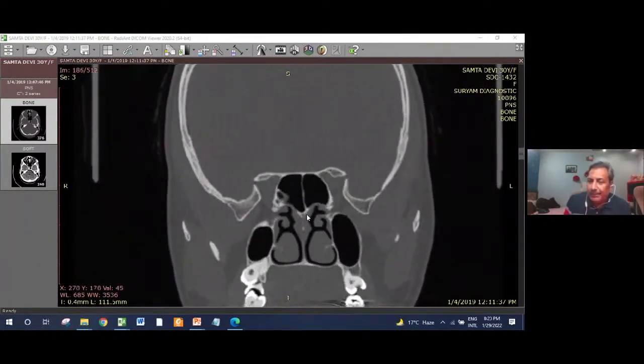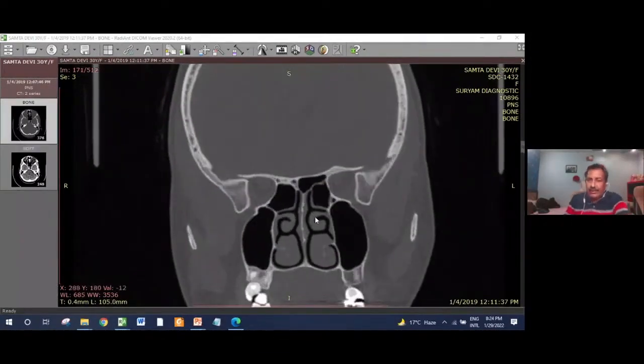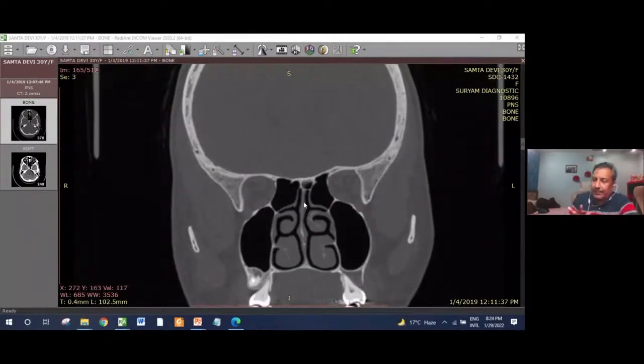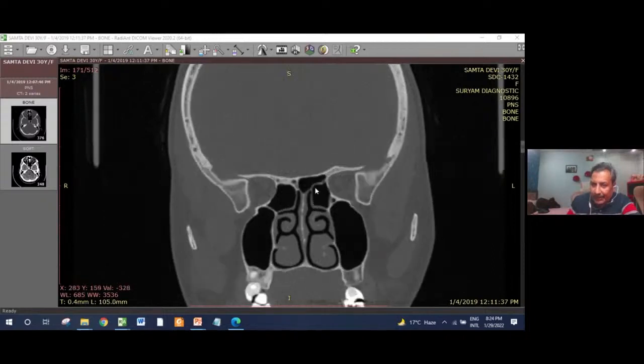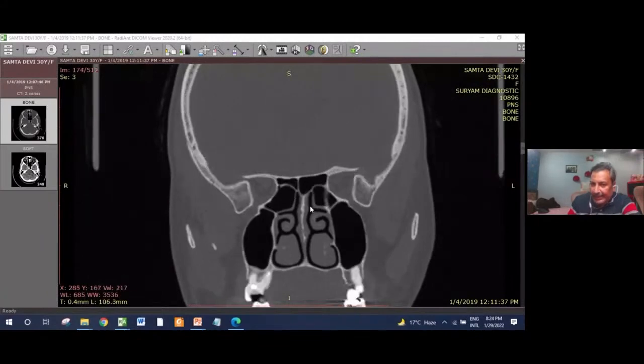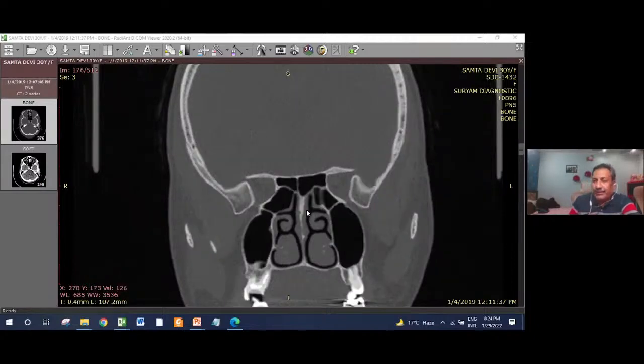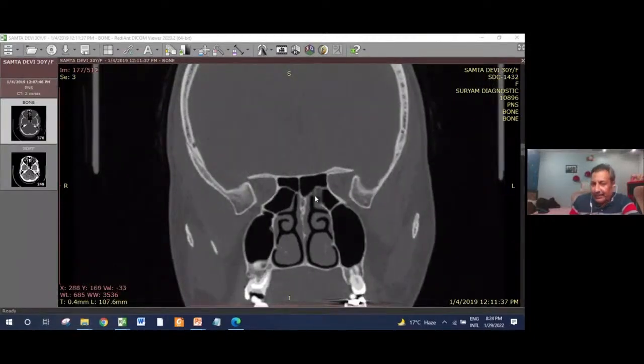Now, another important thing, to deal with the sphenoid sinus ostium, this is a standard teaching in our practice to emphasize medial entry to the sphenoid sinus. See this? That's the posterior ethmoid cell. That's the superior turbinate. That's the level of the superior turbinate. We always advocate stay medial to the superior turbinate as you go behind. Stay close to the septum, and between this, that is the level of the ostium of the sphenoid sinus. See the rostrum here, and that is the level of the sphenoid ostium on both sides.